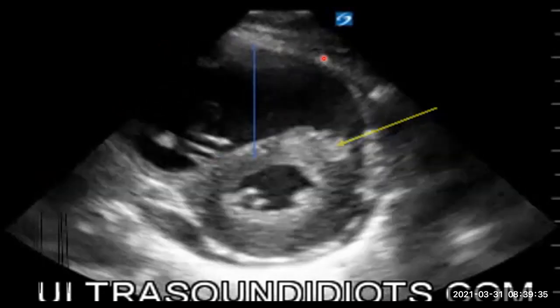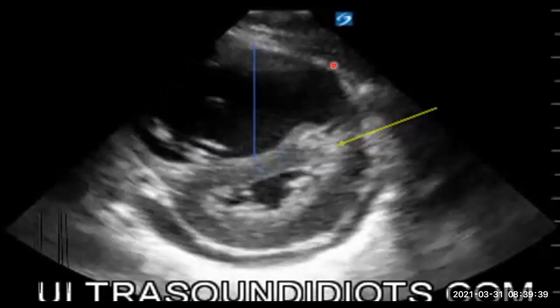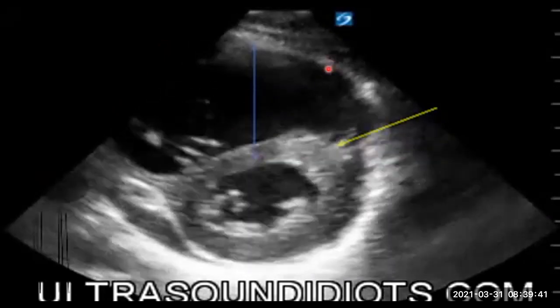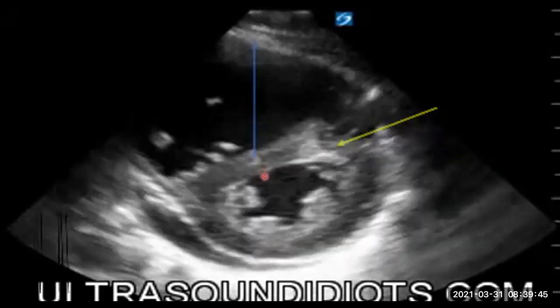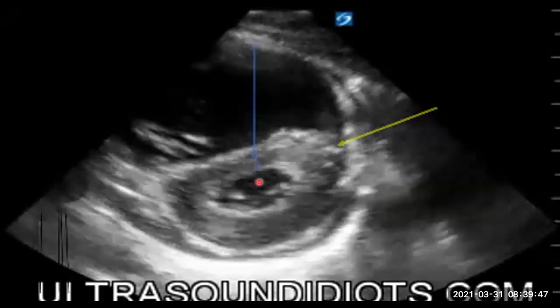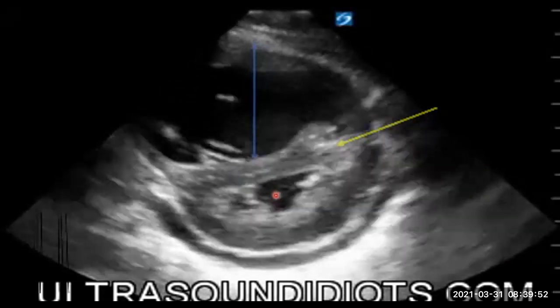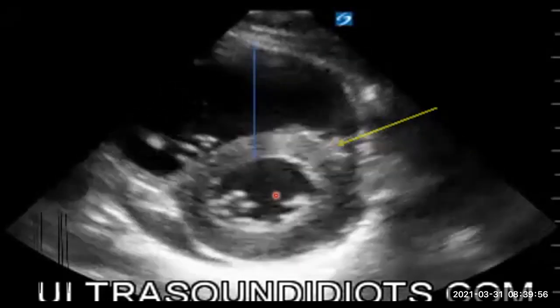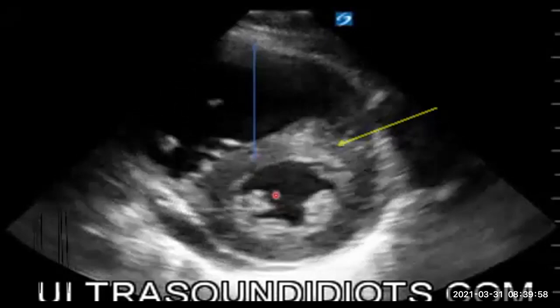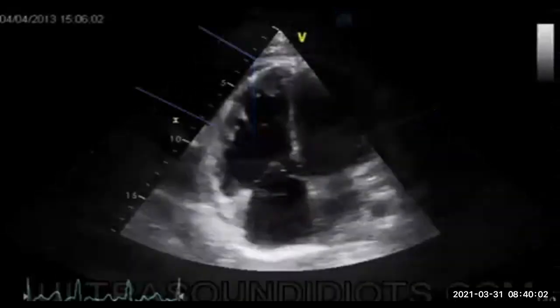Now in this one you can't see the apex because the apex is kind of further down. You move the probe until you get to the apex. Here we're at mid ventricle. And again, you notice the septum falling the wrong way. And you notice the ventricle is very small, hyperdynamic, trying to keep up, but unable. But it makes sense from what we discussed earlier. What we expect. So these are the things that you need to know when you are having a look at it.